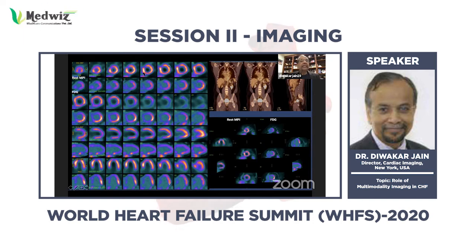So what we see here is enlarged and hypertrophied left ventricle, but there is no definite perfusion abnormality. There is a little less radiotracer uptake in the inferior wall. That's diaphragmatic attenuation, but no perfusion abnormality. There was global severe hypokinesia. Ejection fraction was 34%. On the FDG images, we see very intense and very localized radiotracer uptake in the lateral wall. The entire lateral wall lights up.